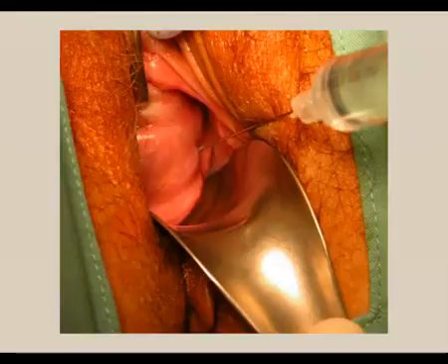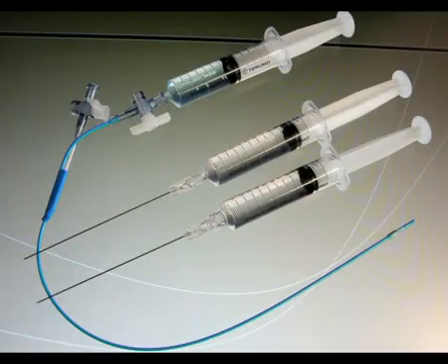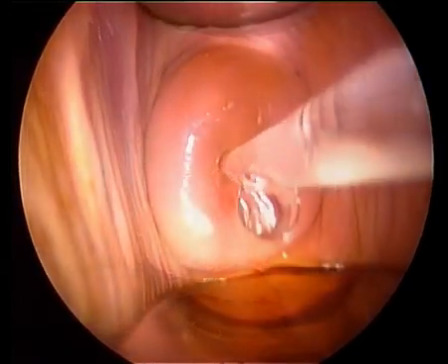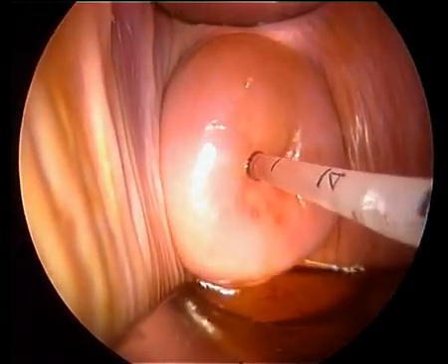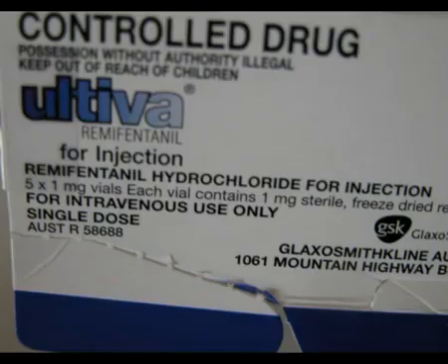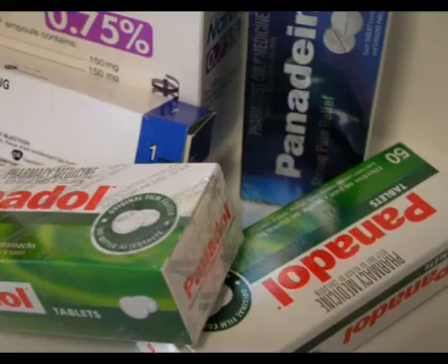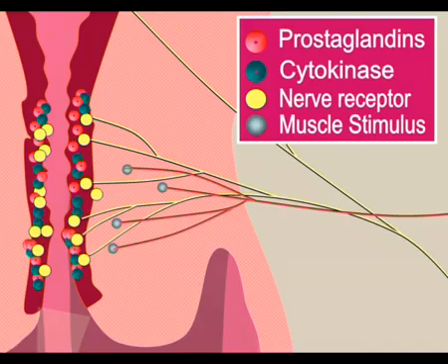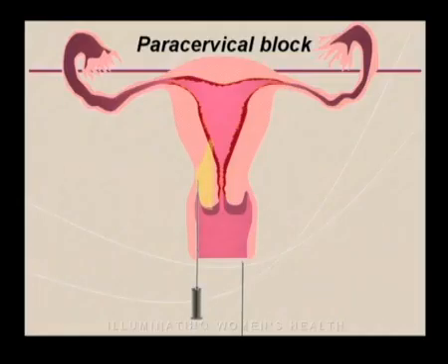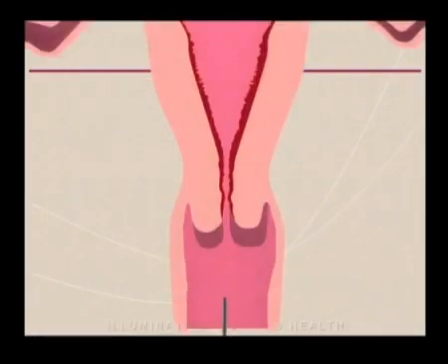Anaesthesia for outpatient hysteroscopy may include paracervical, intracervical or transcervical blocks, or application of topical preparations to the cervix, as well as simple oral analgesics. No particular regimen has been proven to be superior. Indeed, some practitioners routinely perform outpatient hysteroscopy without analgesia. Given the complex nerve innervation of the uterus, transcervical intrauterine installation of local anaesthetic has the theoretical advantage of being able to diminish the sensation of pain in the cervix, uterus and tubes, and without the pain associated with injection.